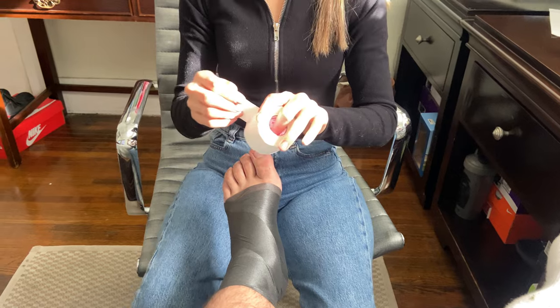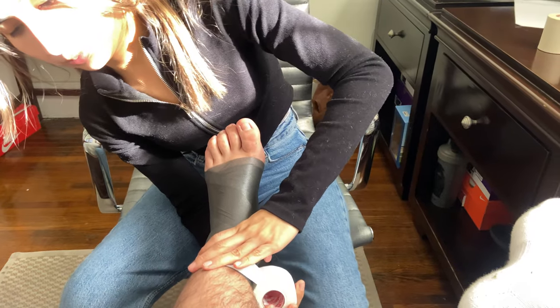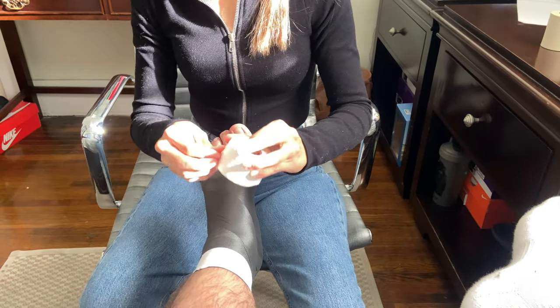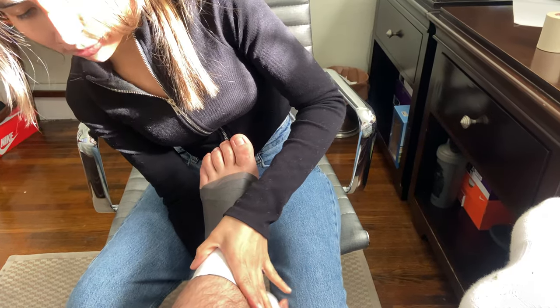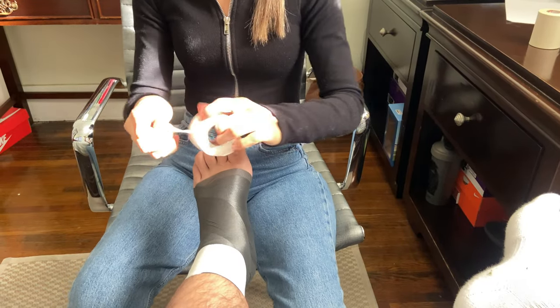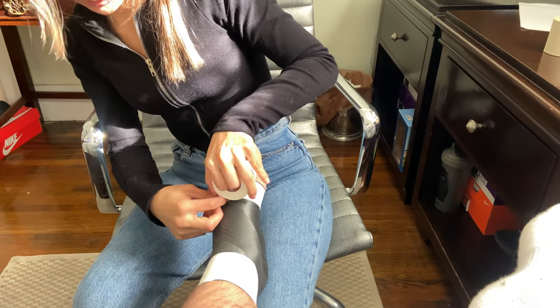Now we're going to go ahead and apply two anchor strips near the calf. We don't want to overlap the tape to the skin because we don't want to rip out any hairs, or we don't want to get in contact with the skin in case the person does have sensitive skin. And now we're going to go ahead and apply one anchor strip distally to secure the pre-wrap.